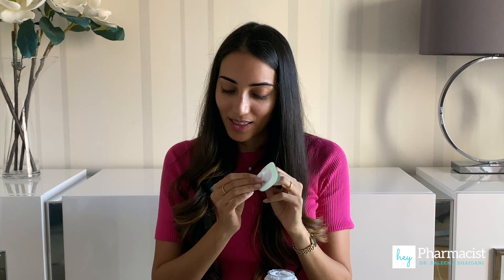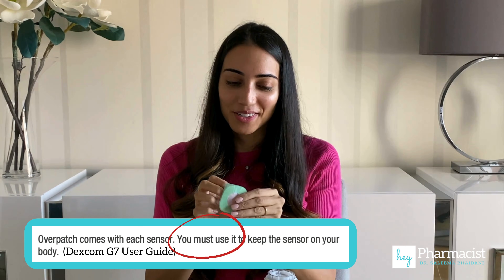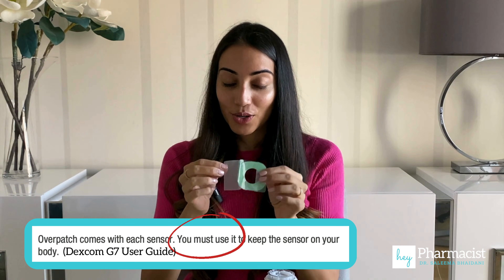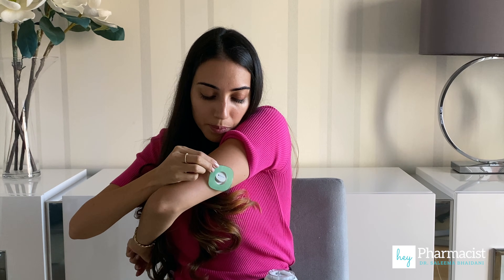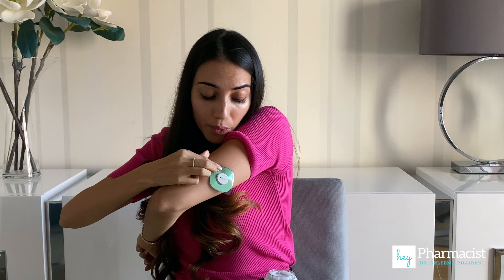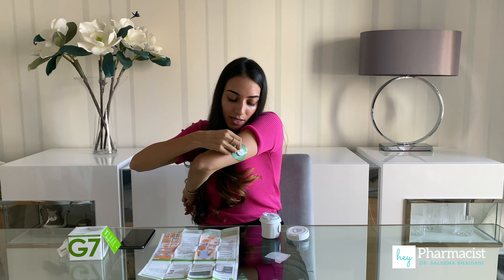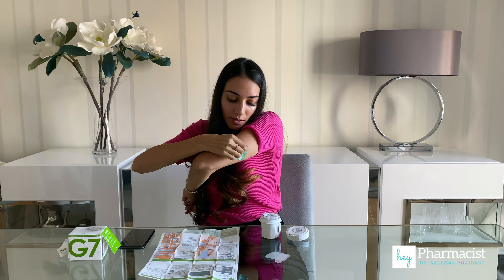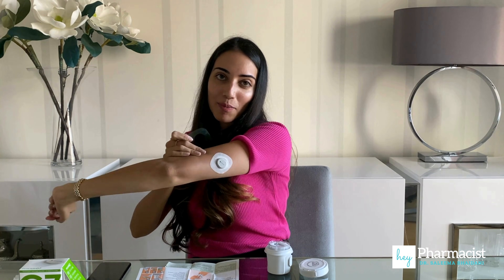The last step is to apply the overpatch, and according to Dexcom this is a must-apply. This is what it says in their documentation. They say it's probably helpful to use a mirror, but in my case I'm just going to try without one. Looks like that's pretty decent — peel this off, and voila, I'm all set up.